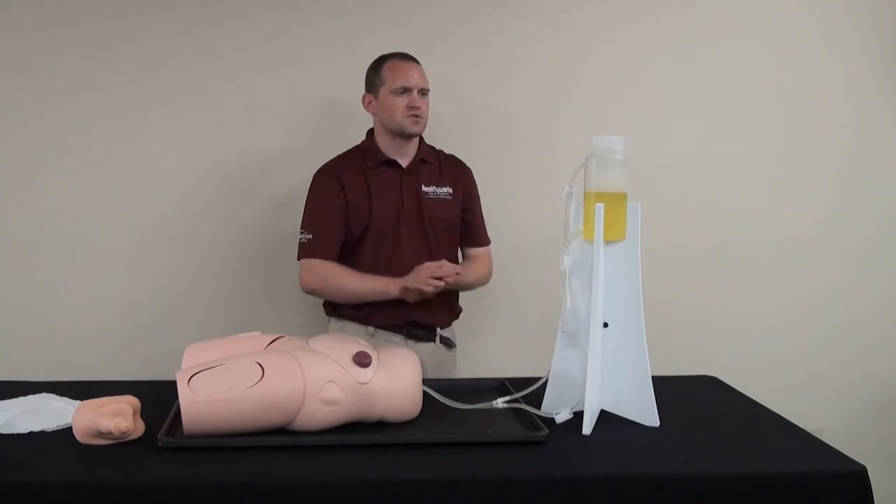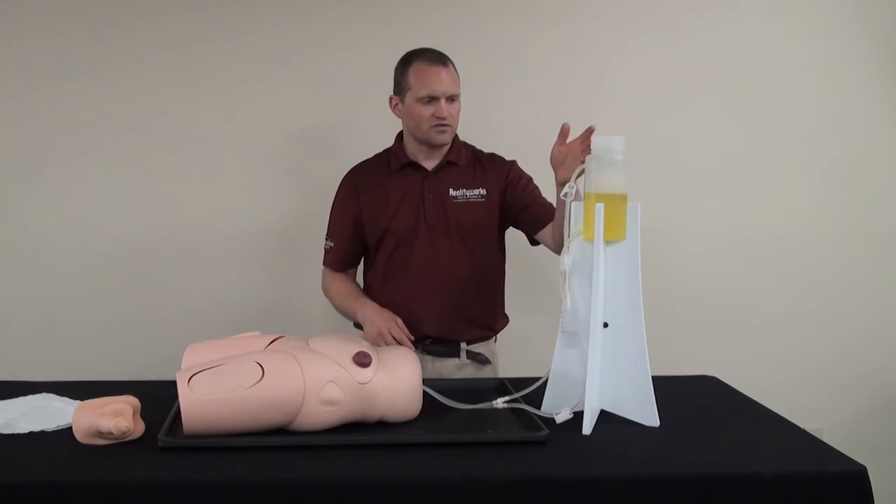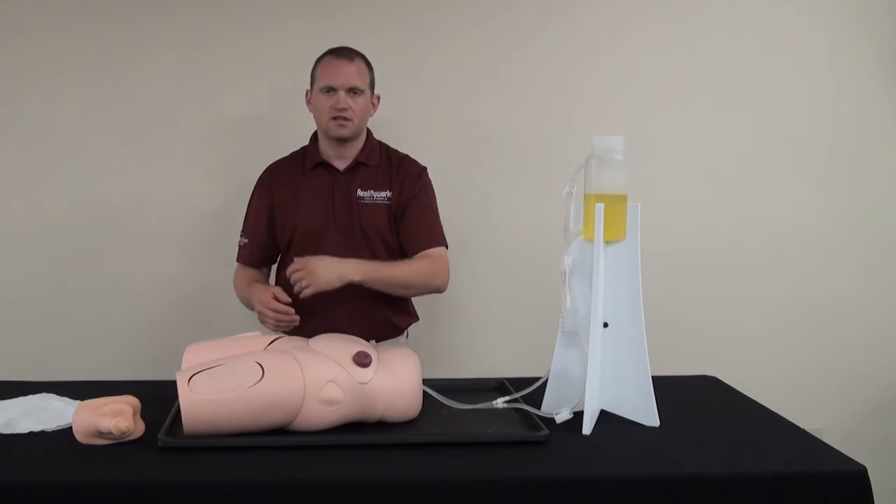It can take up to 30 seconds for the liquid from the tower to feed into the bladder.